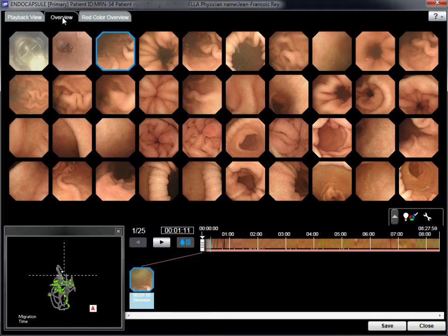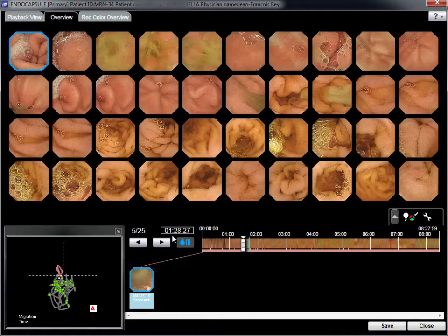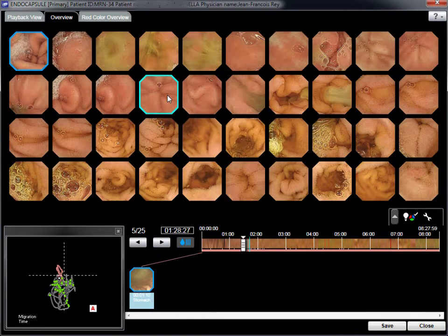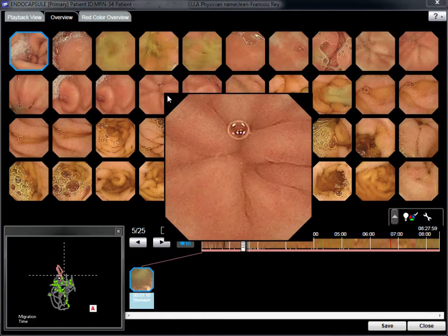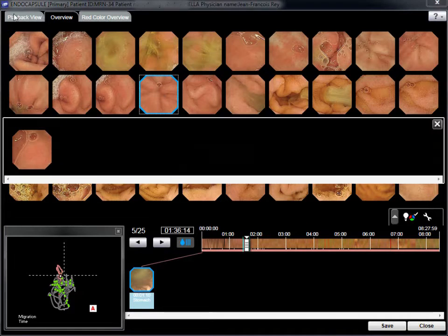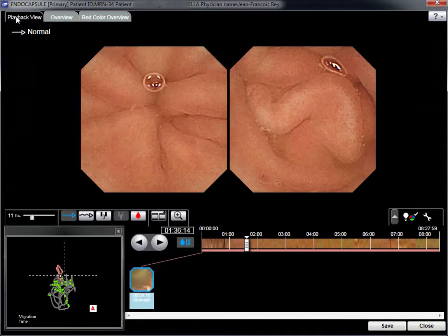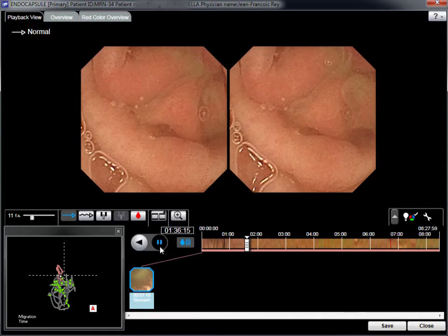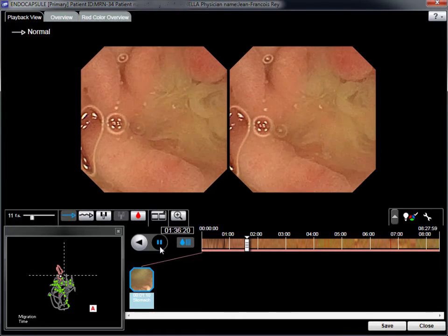Individual images can be enhanced or reviewed using these software functions. However, the diagnosis relies on the express selected mode, which allows selection of video images.